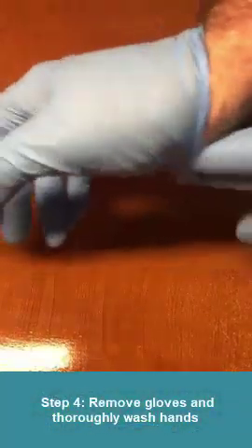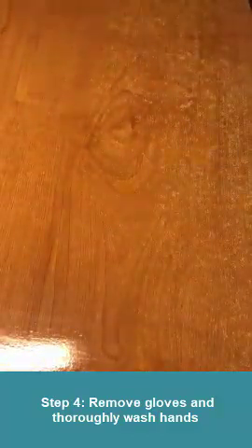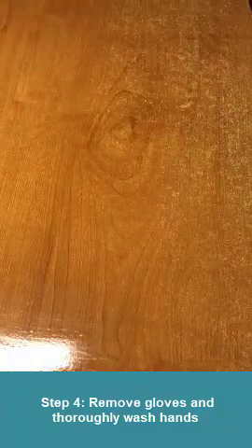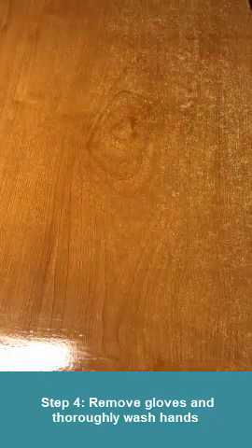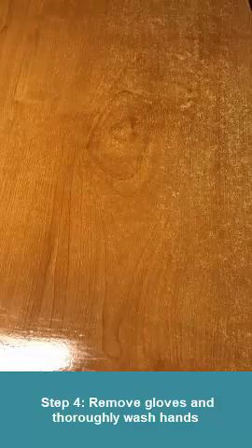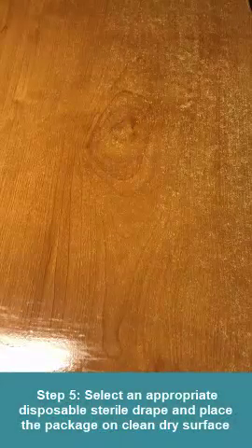Now I'm going to remove my gloves, wash my hands really good this time, get in between the fingers, back of the hands, front of the hands, forearms all the way up to the elbows. Then I'm going to select my equipment.